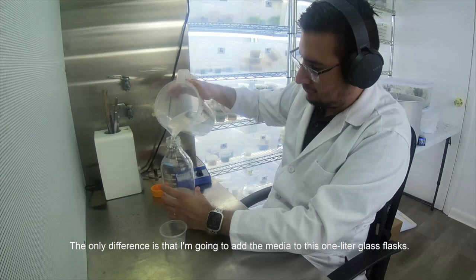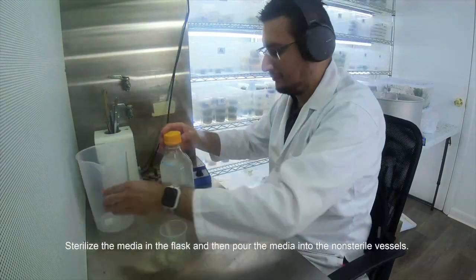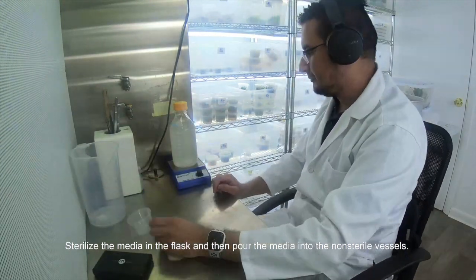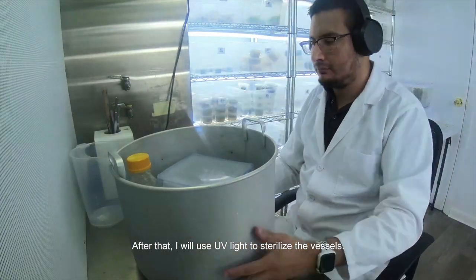The only difference is that I'm going to add the media to a 1 liter glass flask, sterilize the media in the flask, and then pour the media into the non-sterile vessels. After that I will use a UV light to sterilize the vessels.